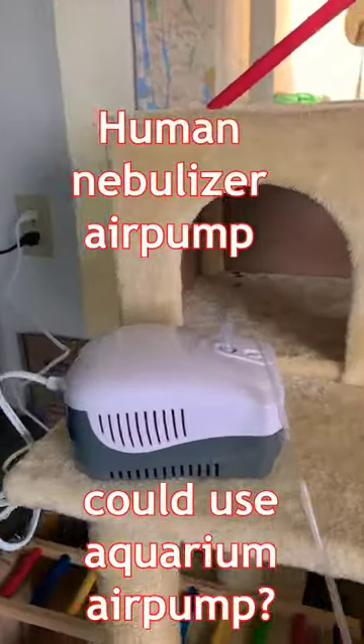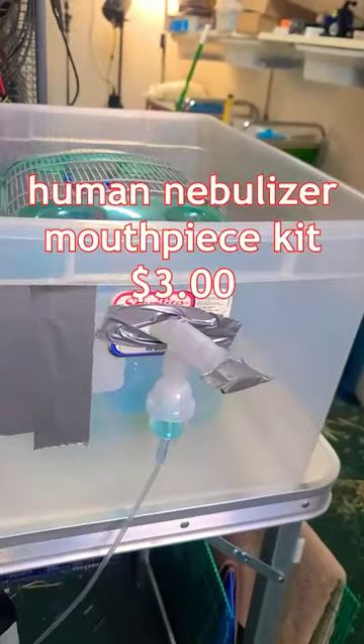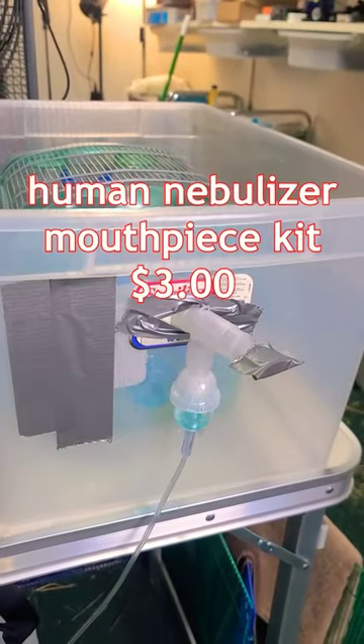What I bought was a human nebulizer air pump. I guess you could use an aquarium air pump — I'm not sure about the space. Pipe it into the box with a piece of plastic tube.